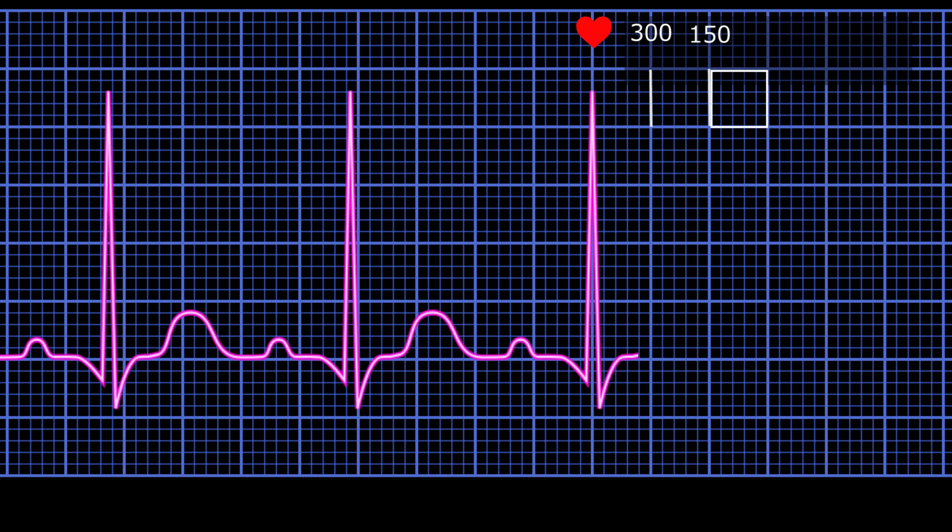And the third large box equals 100. The fourth box equals 75. And the fifth large box is 60 beats per minute. This is just straight memorization of the value of each box, and it can get more complex if you like doing math.